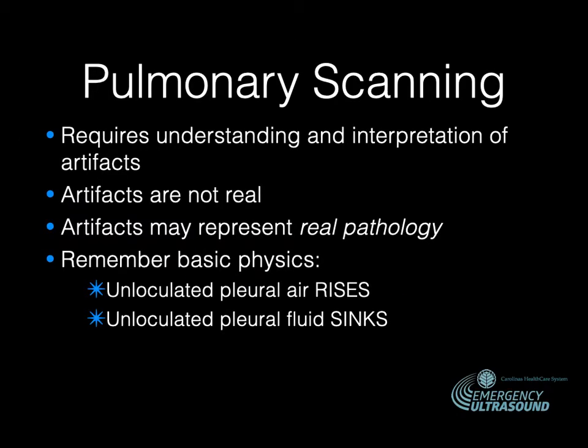Pulmonary scanning requires understanding and interpretation of artifacts. These artifacts are not real, however, they may represent real pathology. Remember some basic physics, a little more simple than our ultrasound physics. Remember that unloculated pleural air will rise and unloculated pleural fluid will sink.